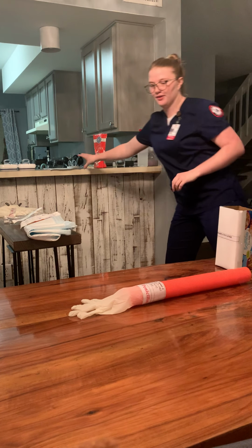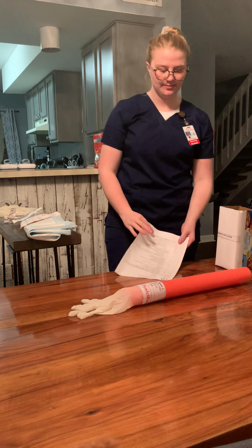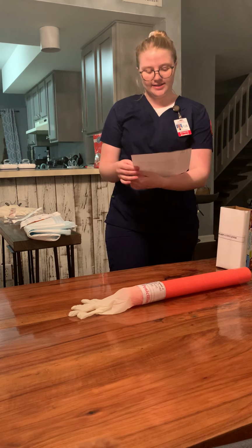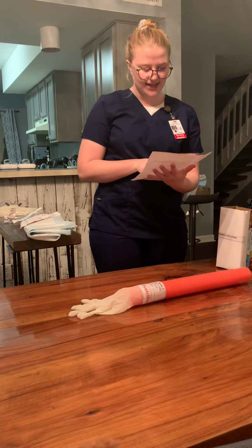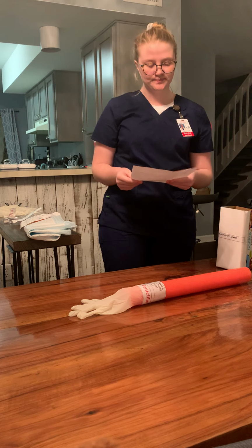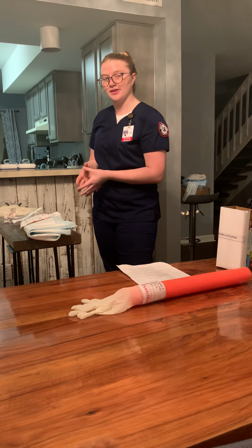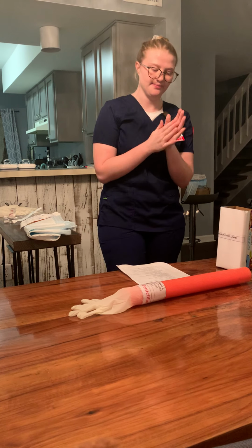And so I would first just begin by checking the hospital policy and order form, which is what I have here. And so there's an order for insert saline lock and AM for CT scan. And so now I would just gather all my materials needed and then perform hand hygiene.